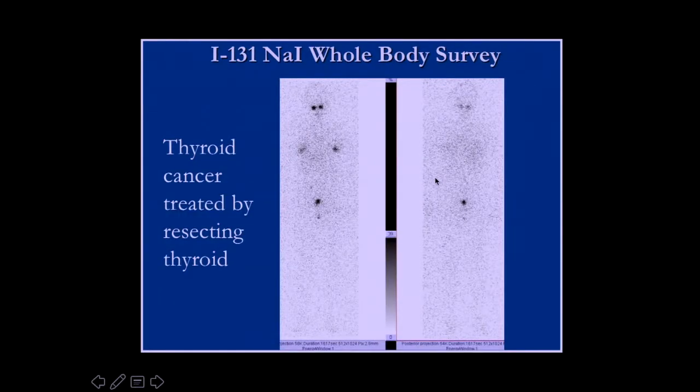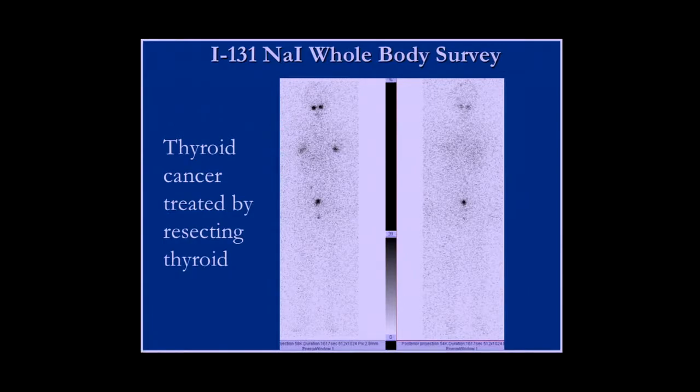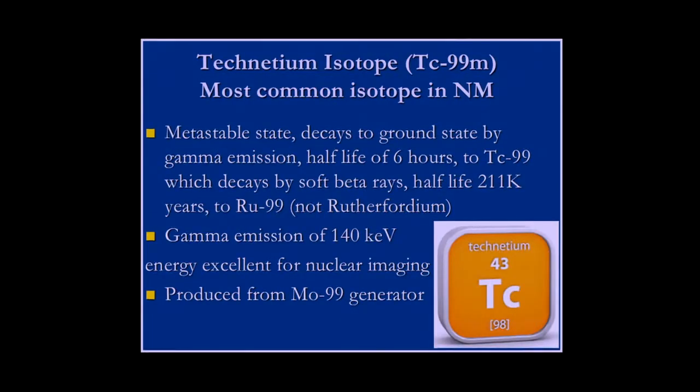Not bad. Here's a patient who's had thyroid cancer removed. And if you look at that, you're going to go, well, I suppose he's right. It's a whole body survey, and these guys are not the eyes, those are the submandibular glands. Breast tissue, she was lactating before she got her cancer. Urinary bladder, this is about 7 days after a high dose of 100 millicuries of I-131 to treat any residual cancer cells. So this was the innovation that really allowed our field to take off.